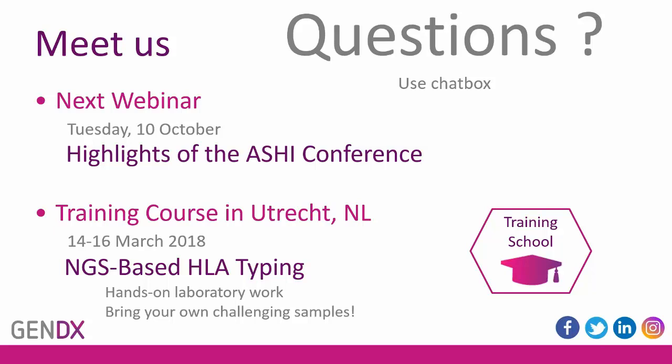Great. And if you talk about automation, the Ion Torrent workflow is of course automated in the sense that you can get the Ion Chef instrument as well. But apart from the Ion Chef, the workflow is quite similar to the Illumina workflow, which is already automated. So it can easily be automated on other liquid handler systems, because it is so similar to the procedure used for the Illumina platforms.